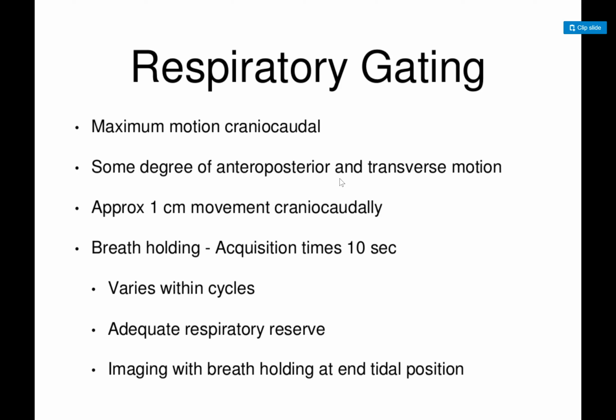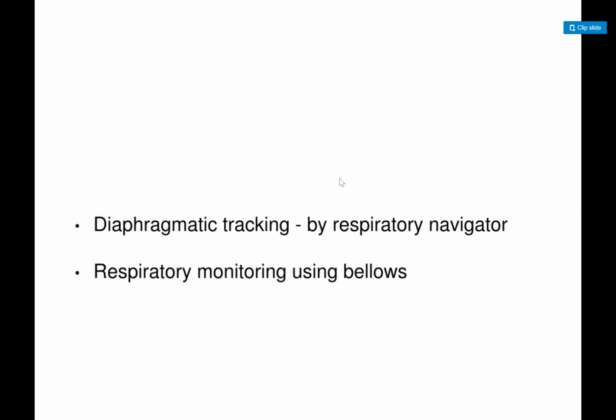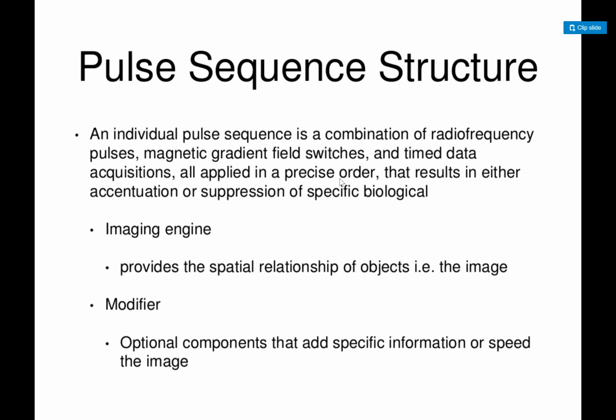Now at UMass, we are able to do it now. It's case by case basis, and we have successfully done few cases. So if there are any concerns, we have to set that up before going to the MRI suite. There are also some advanced things that we do not have available, but you can track the diaphragm using a respiratory navigator and other things that can take this into account.